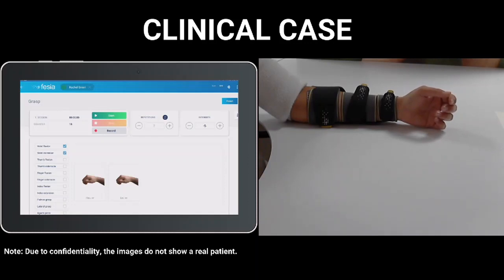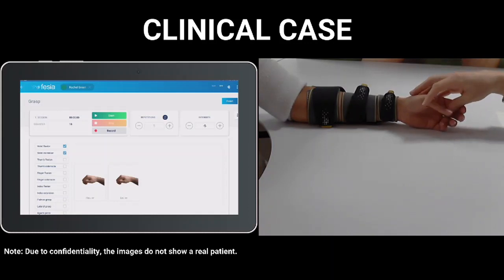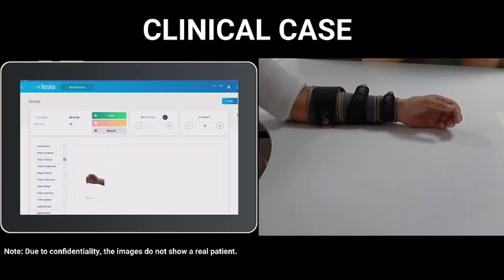Perfect. Now we will repeat the same, okay, Rachel, but with the next movement, which is going to be the thumb flexion and thumb extension, okay? Let's select these two movements. Here I have the repetitions configured continuously, but it is also possible to establish a number of repetitions, but I am going to be working until I press stop. So I press it continuously and I press start. Now I will increase the intensity. And you can see that the movement is extremely selective.